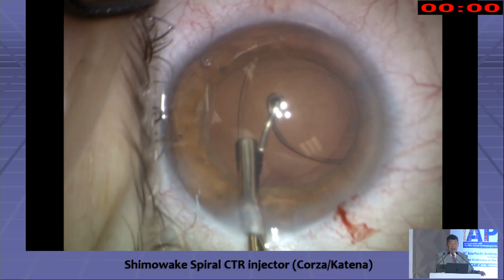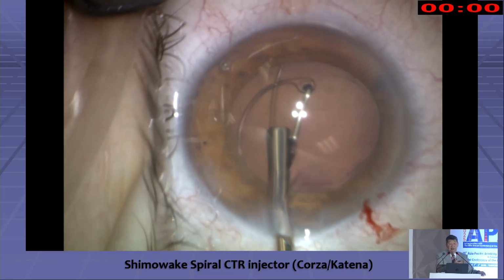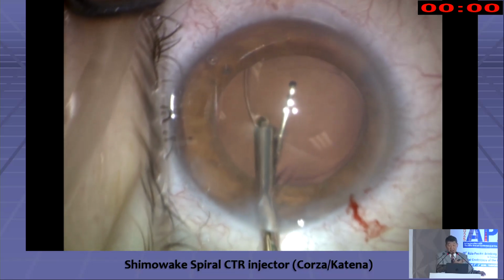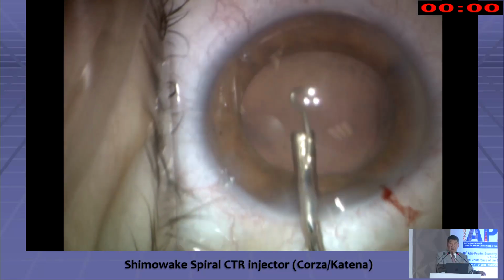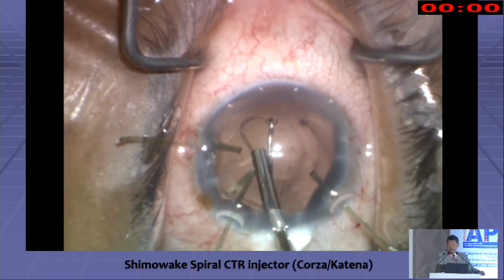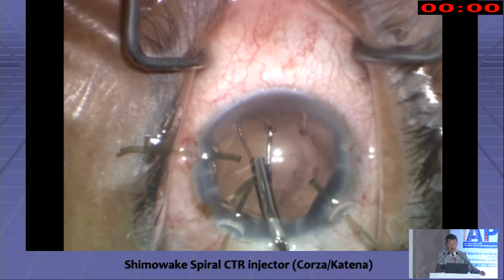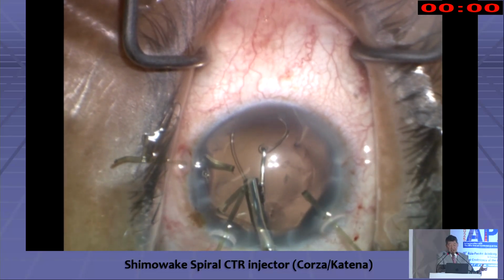To disengage, I'll turn everything slightly to the right, and that lead eyelet will fall off first, and then the trailing eyelet usually falls off second. This is obviously reusable. And it's really nice when you have capsular retractors already there, because as you know, this kind of runs into the retractors.